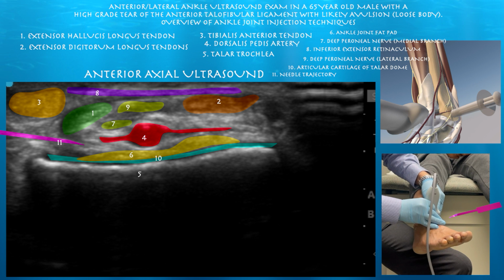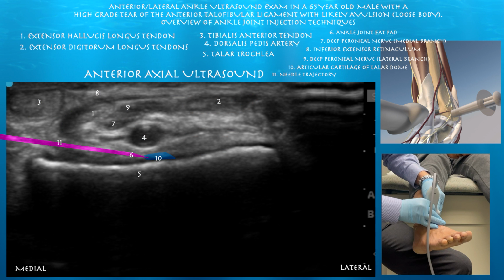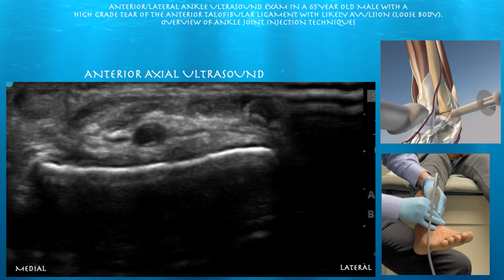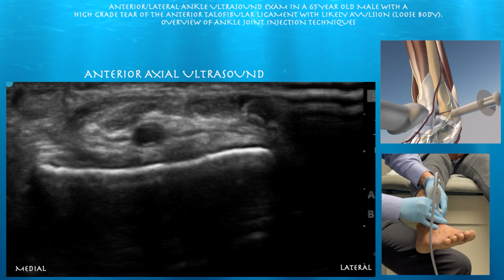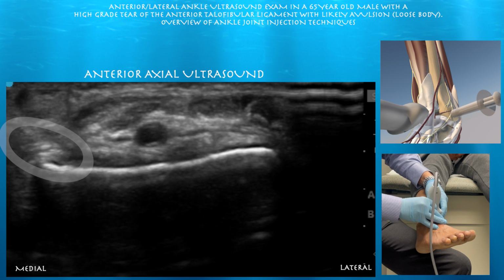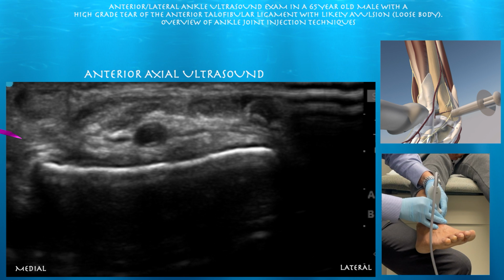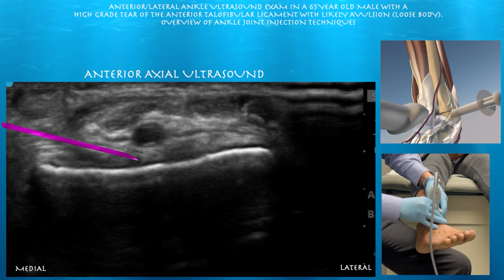And this is a different technique of doing an injection, where you go from a medial to lateral direction. You're going kind of against the grain of the tendons, but you want to get your needle just above that hyaline cartilage underneath the fat pad. Here I am pushing with my finger just under that tibialis anterior tendon, which is what I do before any injection to get a sense of where the needle is going to head.